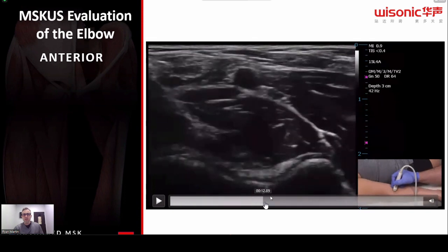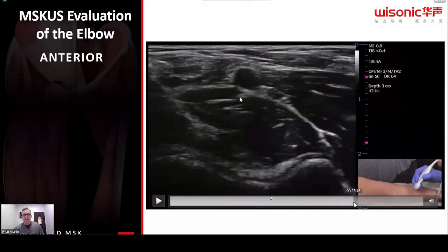And then you can see the cursor here. First thing you note is that big brachial artery up at the top. That's right outside our triangle. Then we move over to this region here, which is that big median nerve. They go together in tandem, so they follow each other down the arm. So if you know that you can find this big arterial space right here, you know that median nerve is not too far away. As we work over to here, you can see the big pronator. This is the pronator teres group right in here. And then as we work our way down to that big muscle group at the bottom, that's the brachialis. Okay, so we're just following that triangle here.